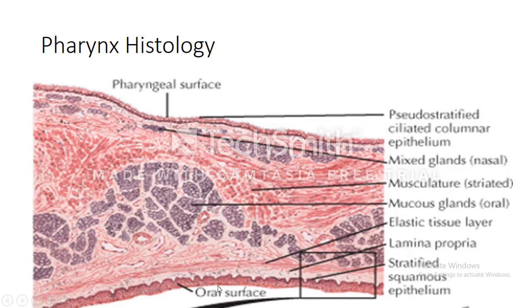And this part is joined to or near the oropharynx. The oropharynx has a mucosa. This mucosa consists of stratified squamous non-keratinized epithelium and lamina propria, and areolar loose connective tissue.